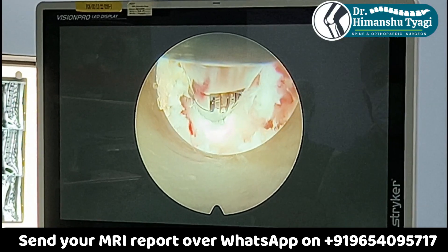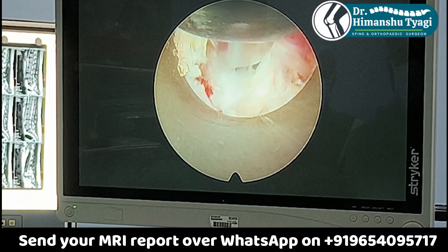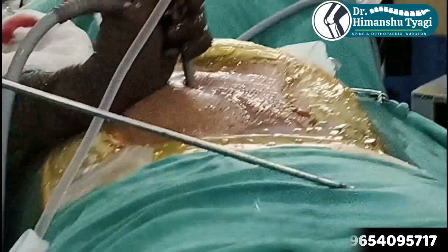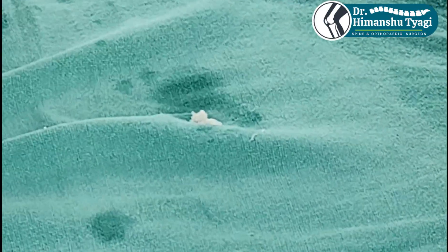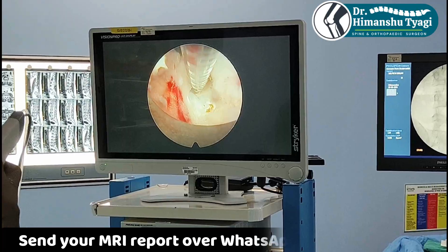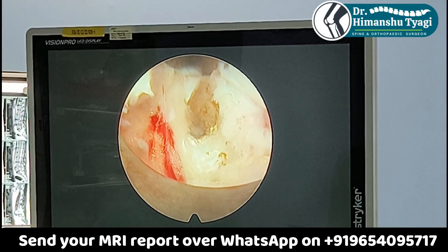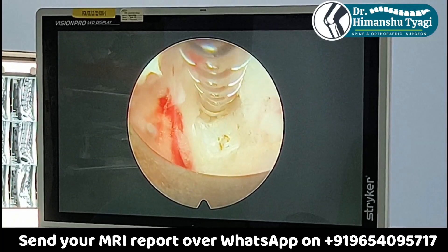We normally remove 4 to 5 fragments. Importantly, we do not remove the entire disc and we do not remove material from inside the disc, because otherwise that would lead to back pain in future. We only target the part which is causing trouble, and once we remove that part we make sure to burn and make the rent also small.